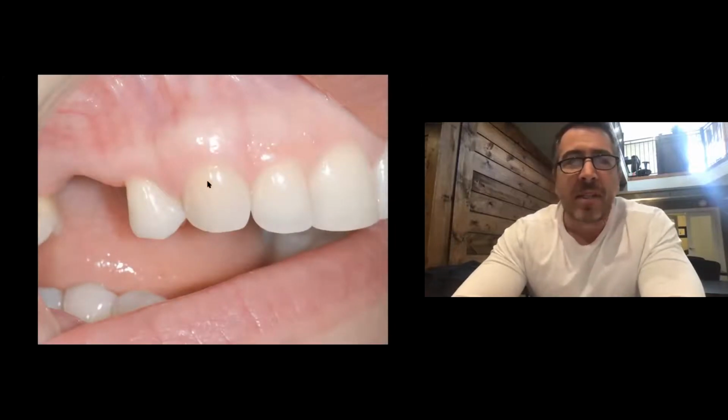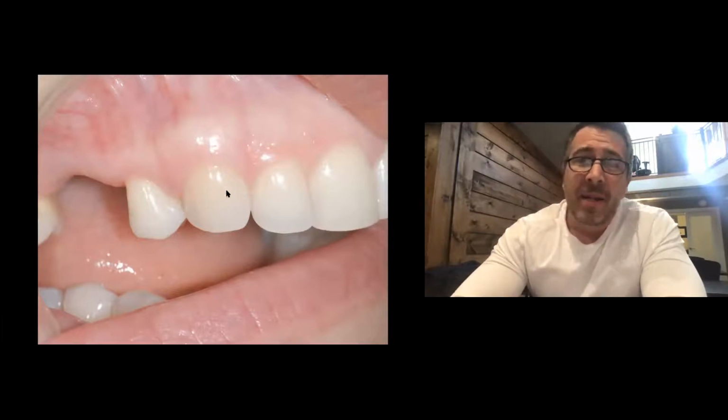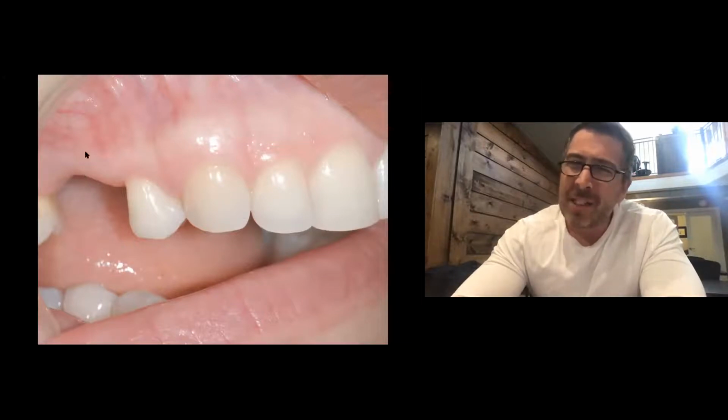So let's look at cases where we extract teeth, place implants, and do the temporary restoration same day. Difficult case, very pretty lady, friend of mine. She has a high smile line. She's got really nice teeth. We've already done extraction here, and she had a sinus lift here. So we've lost papilla on the distal of the 4 a little bit, but she's going to lose the cuspid.